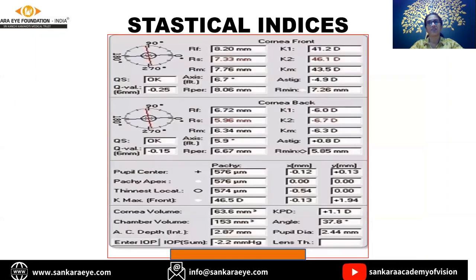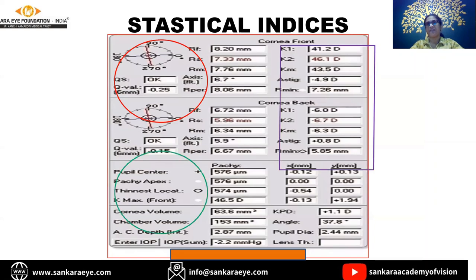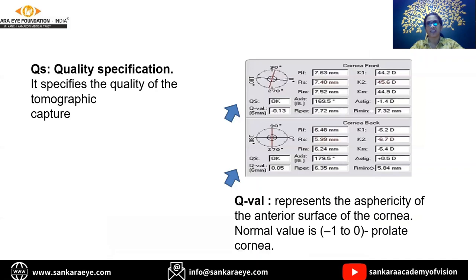Statistical indices we classify into three groups: quality specification and Q value; keratometric values; and pachymetric indices. QS is quality specification - whenever you are reading a map, this should show 'OK'. Anything showing data error, or displaying yellow or red color, indicates that the data shown is not actually what is in the patient's eye - it is an extrapolation the computer has done, and you need to repeat the topography.